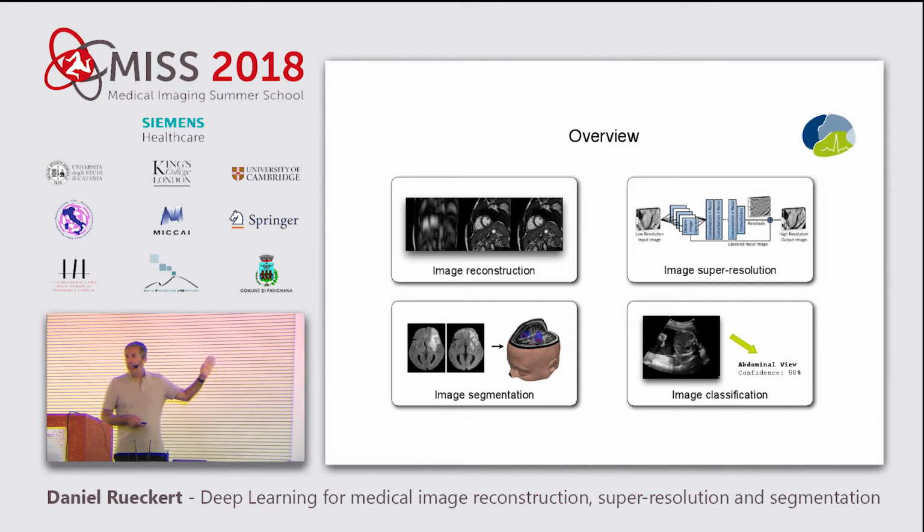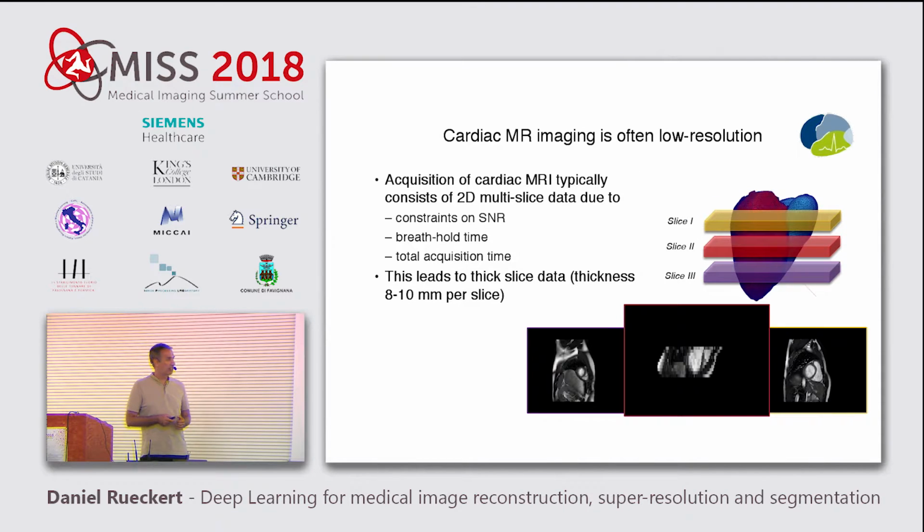So I've told you that I can acquire my data with all these fancy techniques I showed you previously much faster, and I can do so, but I'm still limited to acquiring 2D data plus time in one single shot of acquisition, which means that if I want to make a truly 3D picture of the heart, I have to acquire lots of slices using the technique I showed you before.